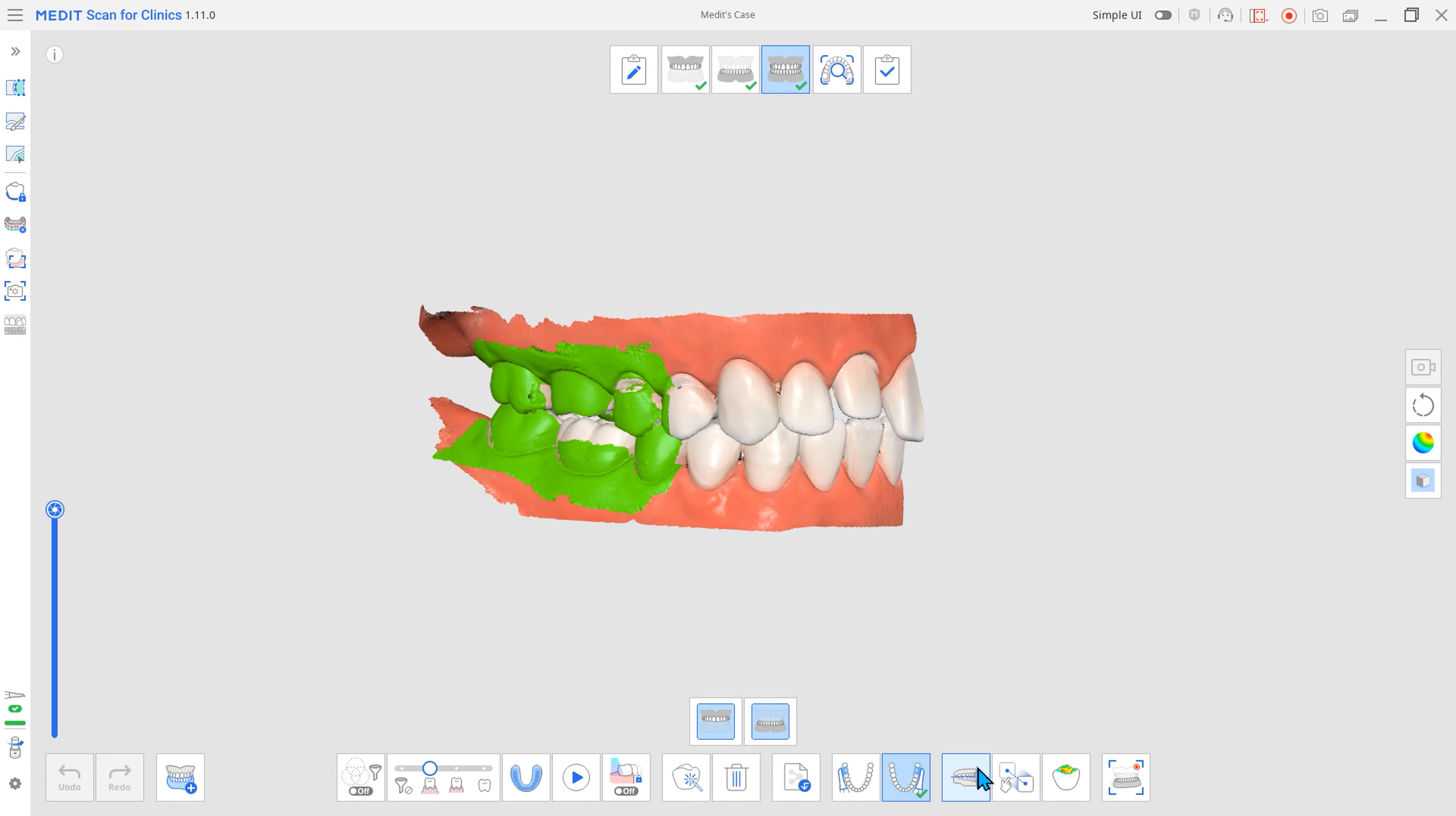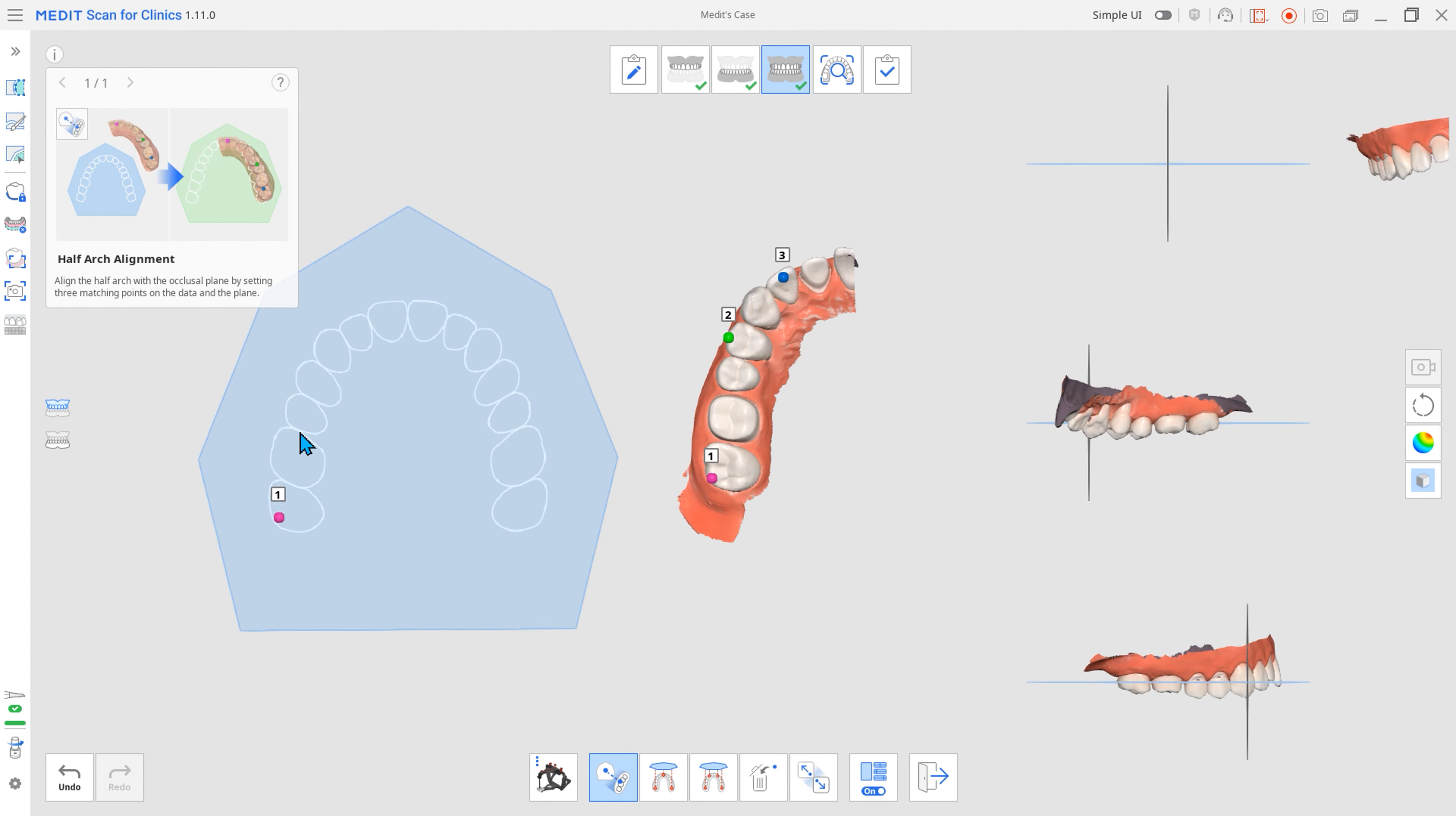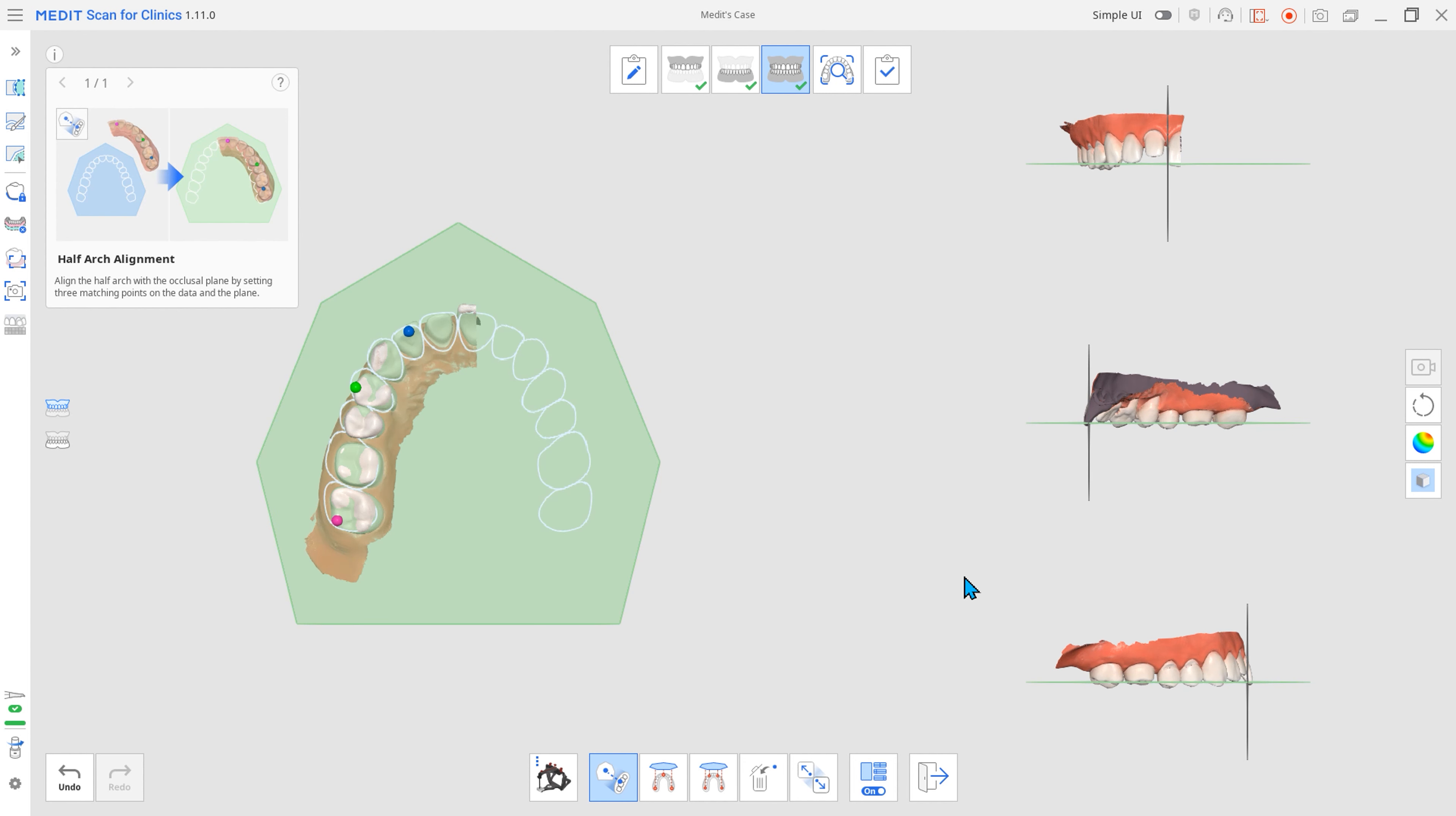Next, you can now use the Align with Occlusal Plane feature for half-arch data. You can position half-arch data on the occlusal plane and use virtual articulators.